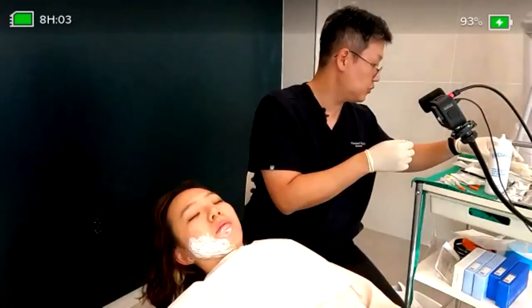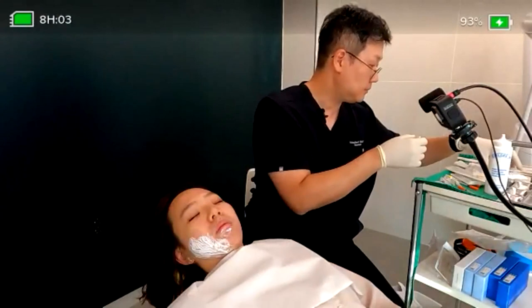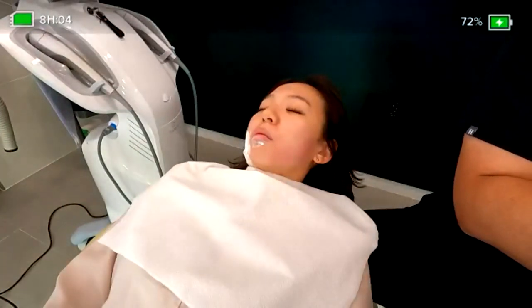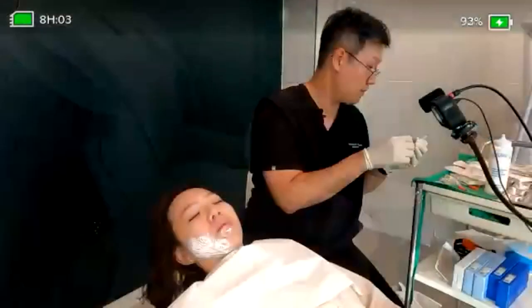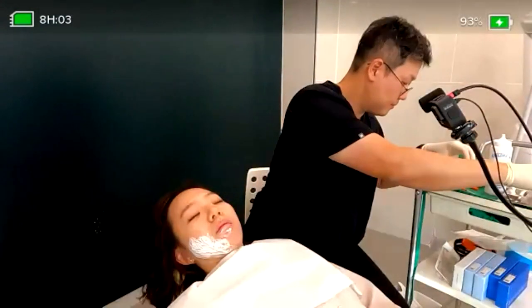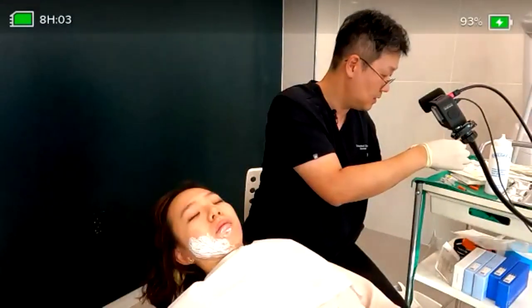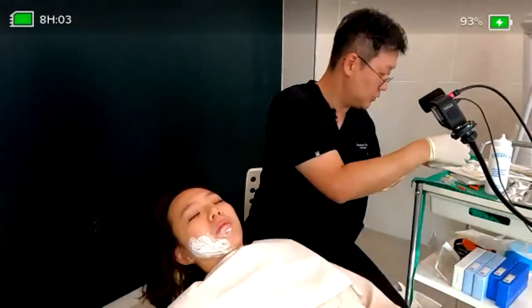And now we are using the 28 gauge cannula here. So we need 25 gauge needles.